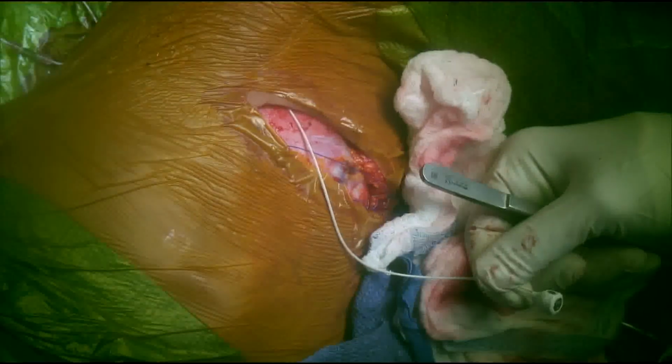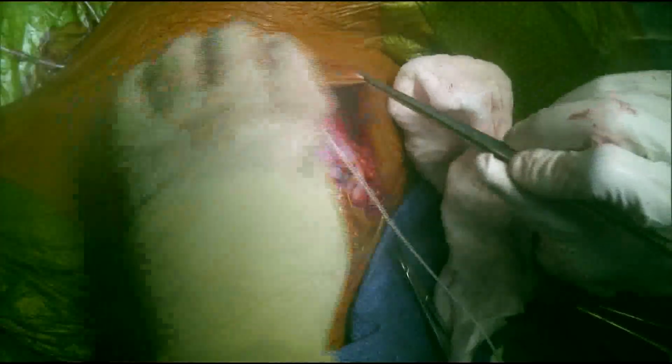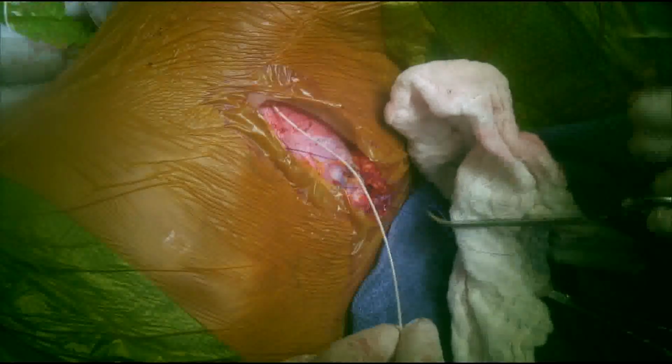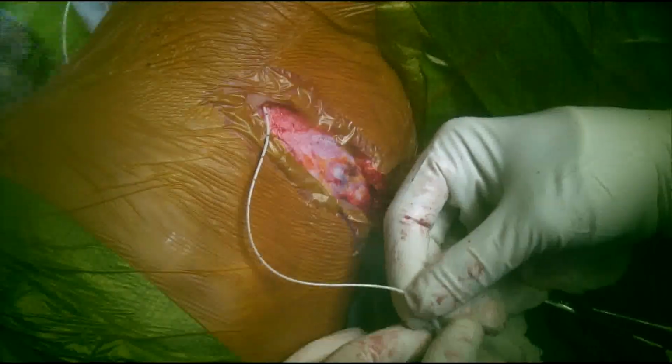After cutting the excess length from either catheter, both catheters are connected at the spinal side using a company-provided catheter connector. You should then wait and observe for CSF backflow coming from the pump side segment or the abdominal side.